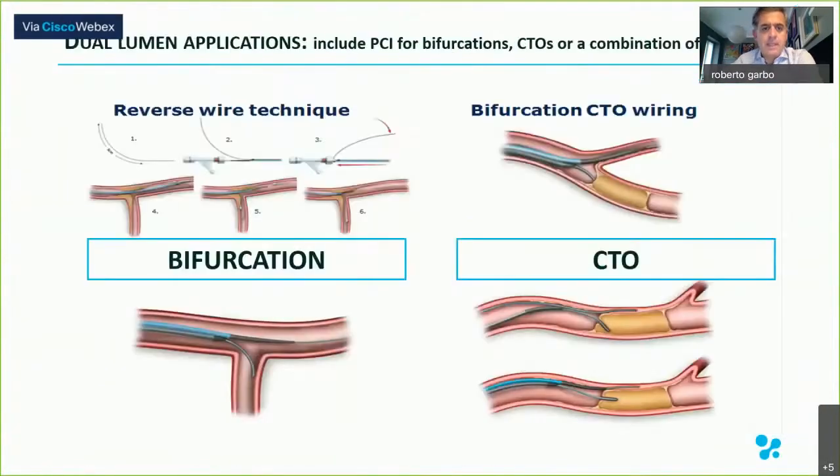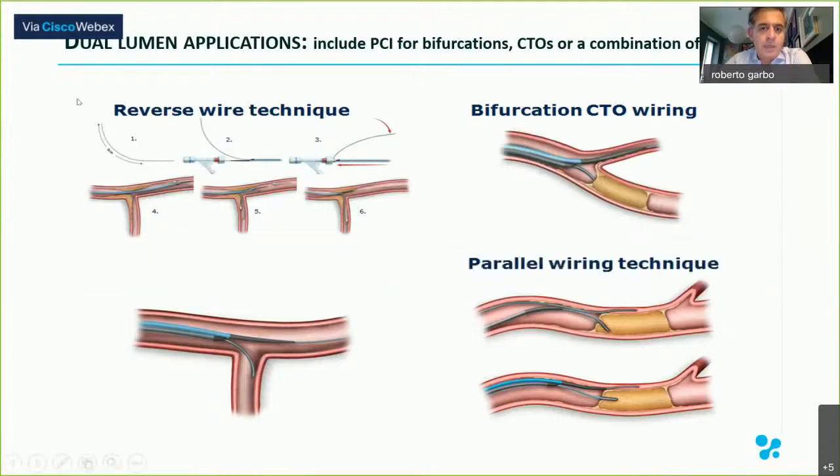This is your case, and what you said at the beginning of the webinar is right: in a sort of learning curve of a CTO operator, the Antegrade approach is the key of our procedure, and we can have really complex Antegrade CTO PCI. Antegrade doesn't mean easy, because people sometimes think that complex CTOs are only retrograde CTOs. Sometimes having a retrograde possibility makes the procedure much easier.